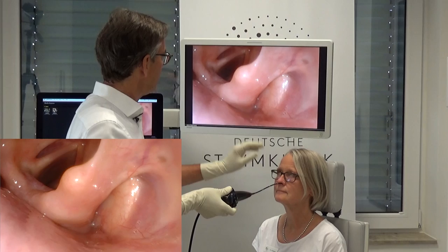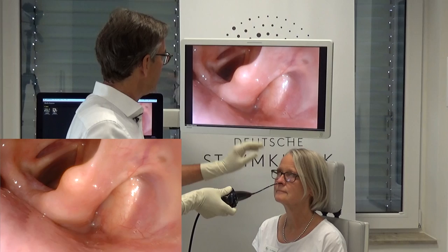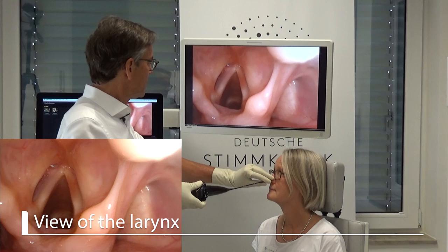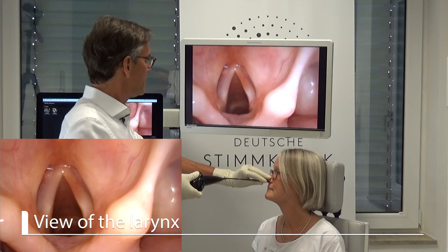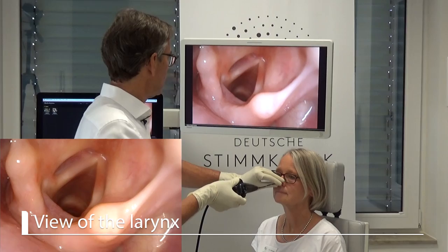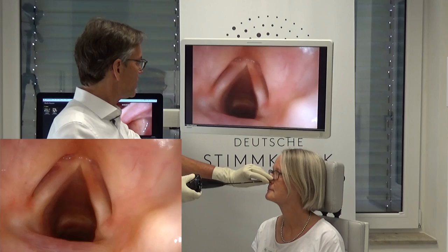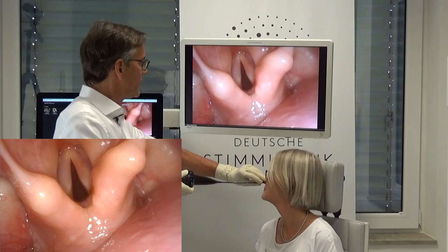As you can see, when I rotate 180 degrees I have an oblique view into the larynx. What I want is to come back into the larynx from the straight position. Turning her head to the right gives exposure of the right vocal fold, as you can see. Turning to the left gives exposure of the left vocal fold. Let's turn even more — as you can see this is kind of an awkward exposure, but if you get used to it, it is very helpful.